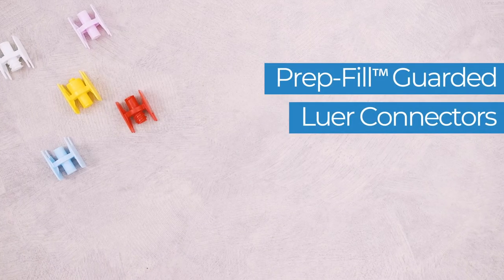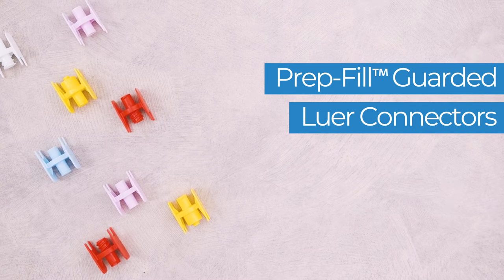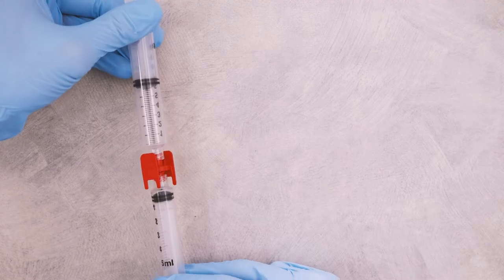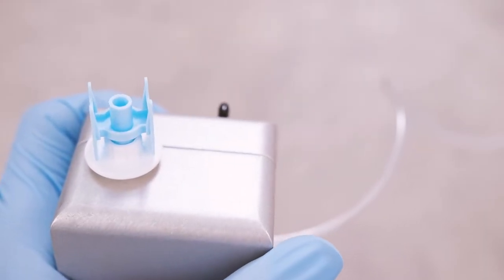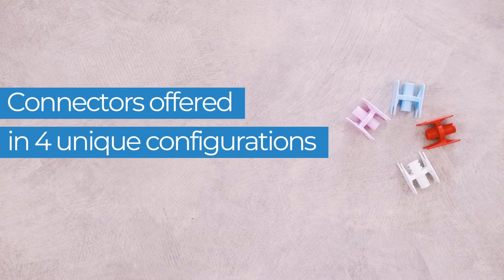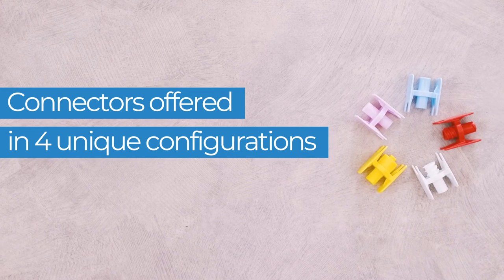PrepFill Guarded Lure Connectors provide pharmacists and compounding professionals with sterile devices for connecting drug delivery devices such as syringes, IV sets, and syringe filling fixtures of repeater pumps. These high quality devices are offered in four unique configurations for Lure Slip and Lure Lock containers.